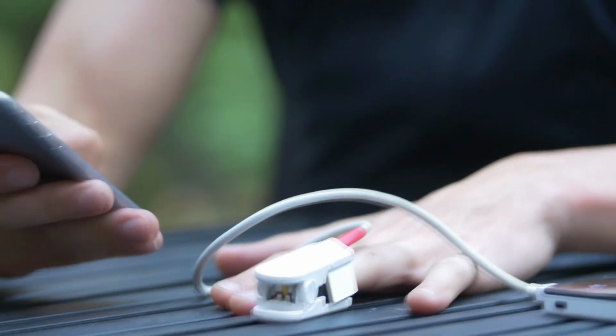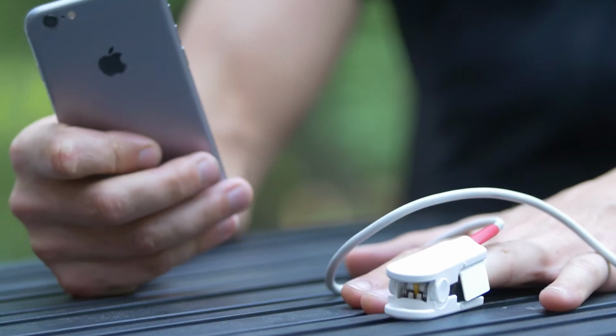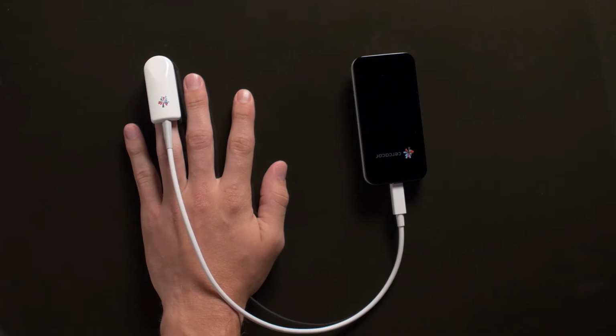To take a proper measurement, always test in the same body position and around the same time of day for every activity you perform. Choose a finger that's free of deformities and without nail polish. If possible, try to use the ring or middle finger of your non-dominant hand. Place your finger all the way into the sensor. The cable should rest on top of your hand in a straight line as far as possible.